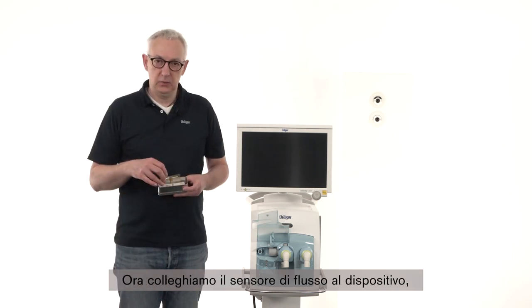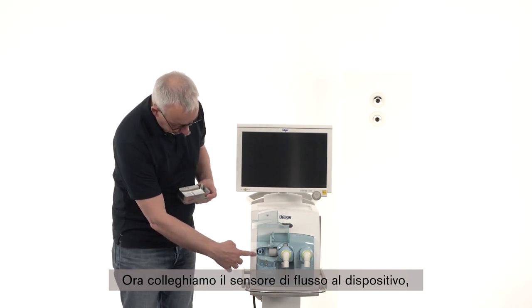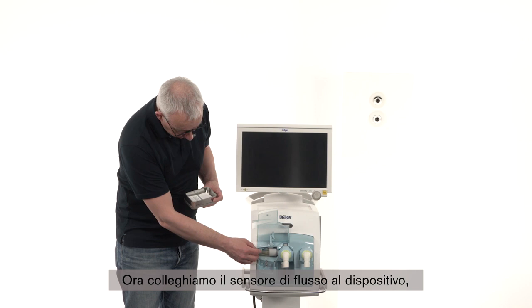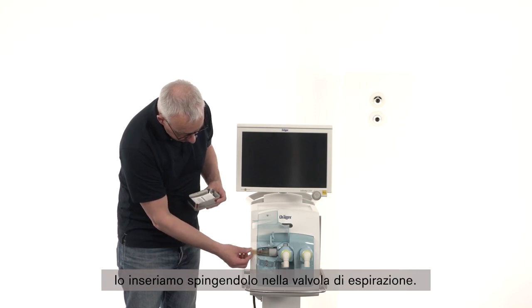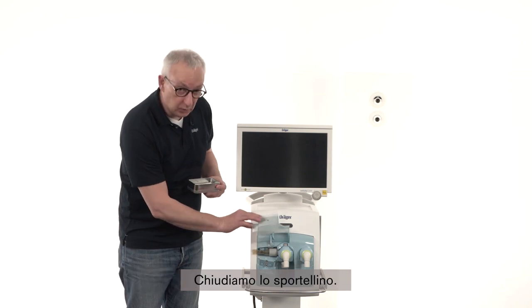As the next step, connect the flow sensor on the device. Put it in and push the flow sensor into the expiration valve. Close the clap.